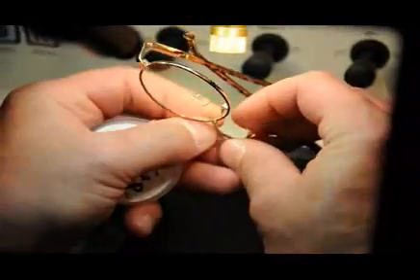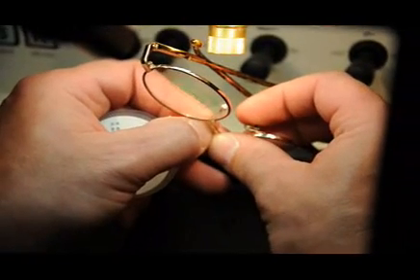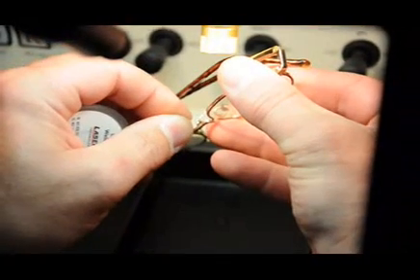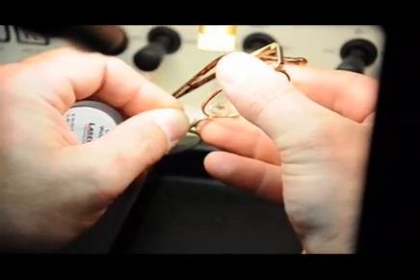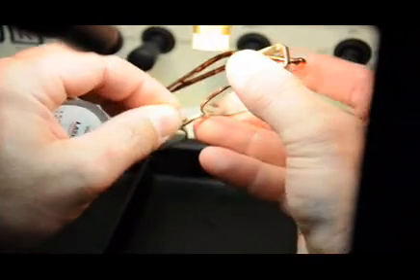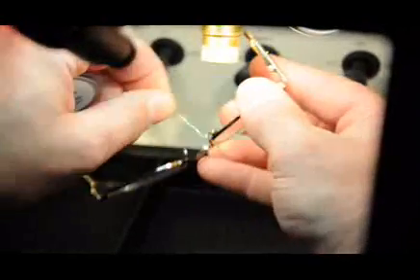Often, with gold-plated frames, a small amount of gold filler wire can be used to return the welded area to the gold-type color. Gold is not required for strength, it is purely for cosmetic purposes. Other methods may also be used, such as a plating pen, or just leaving the welded assembly raw.